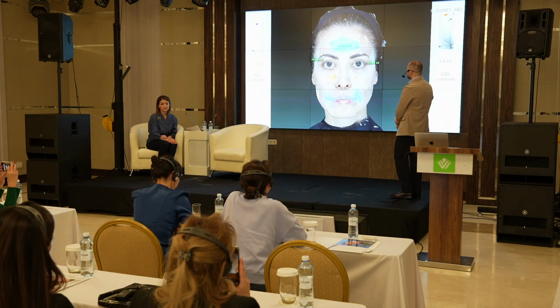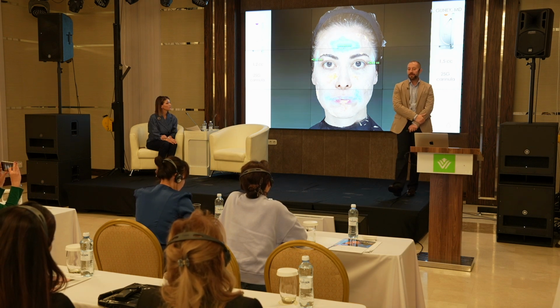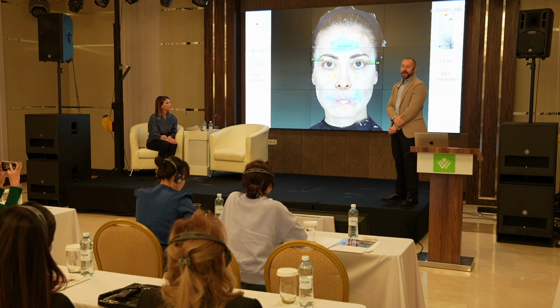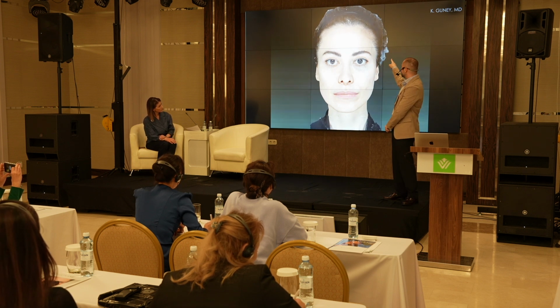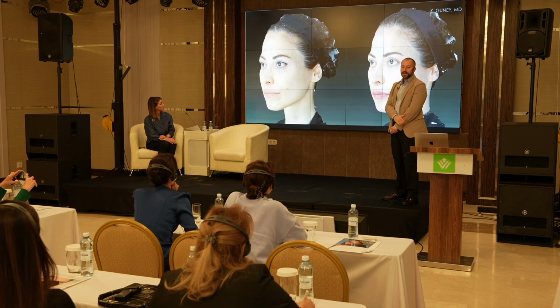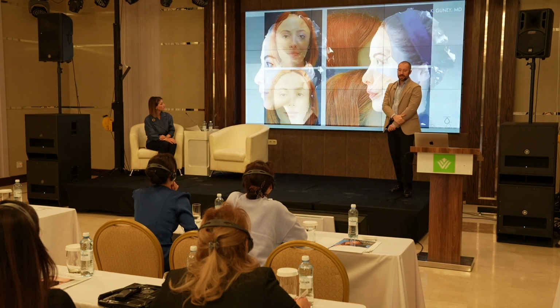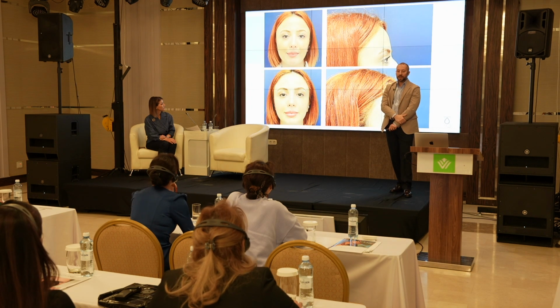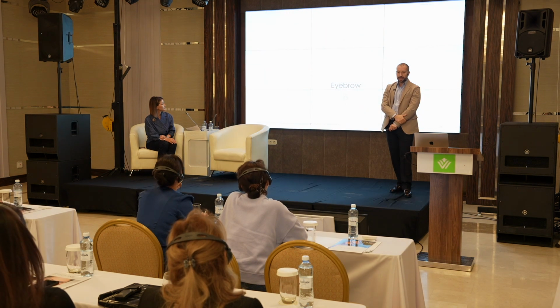So I inject approximately 1.5 cc of RH3 for the forehead area, and you can see the change of the light reflection. Before, 2 light reflections; after the injection, 1 light reflection. So I changed the curve of the forehead. You can see the differences in the profile and in the front. It's more straight, or more curved with injections. Also the other example, to create more curves after the forehead injections.